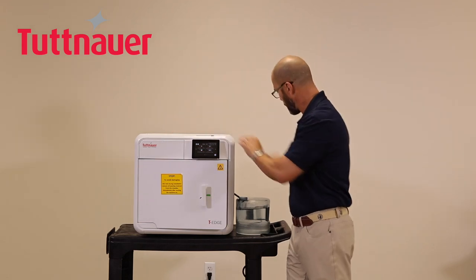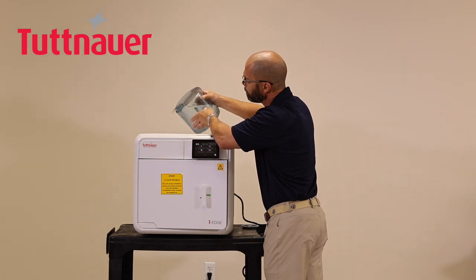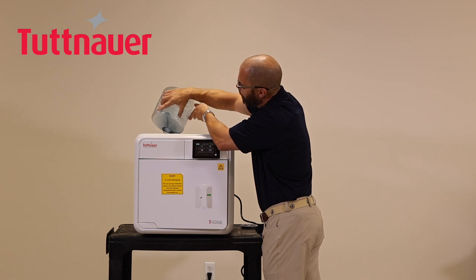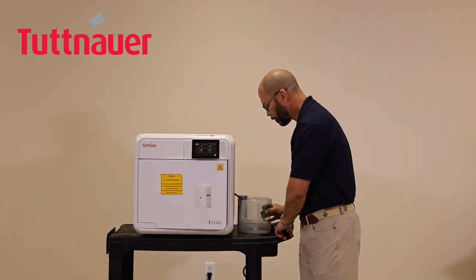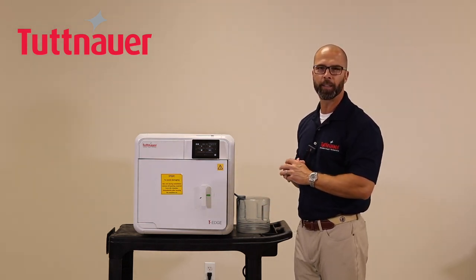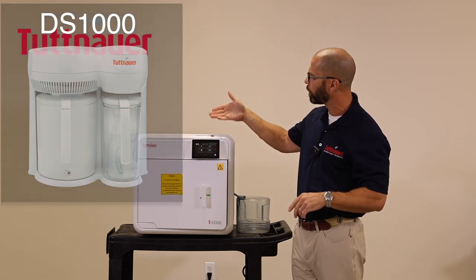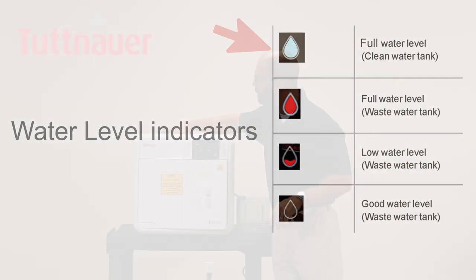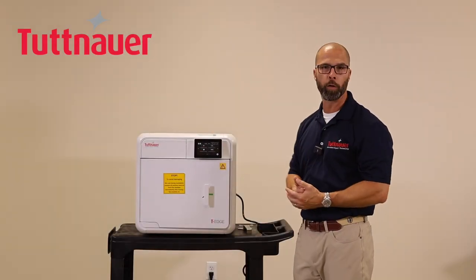To fill the reservoir, remove the lid and pour distilled water into the opening. Tuttnauer also offers its own distilling machine if you'd prefer not to buy bottled distilled water. Once filled, the left teardrop icon changes from red to blue, indicating the reservoir is full and the machine is ready.